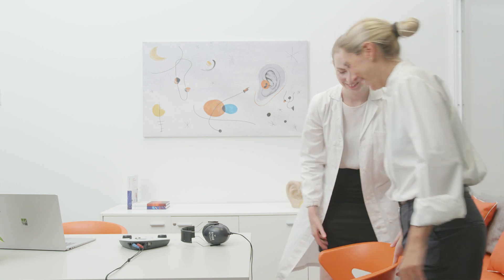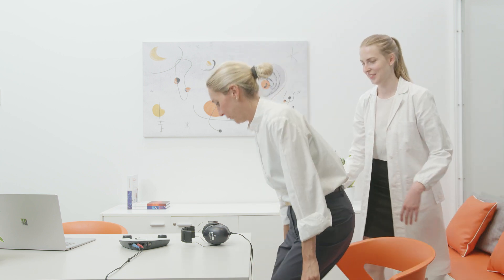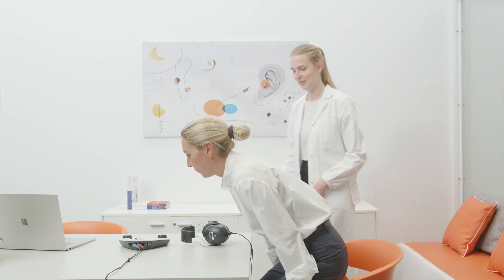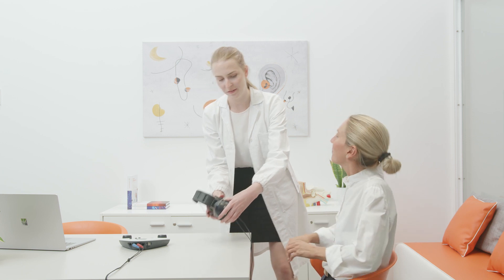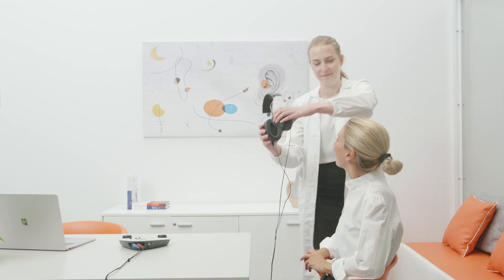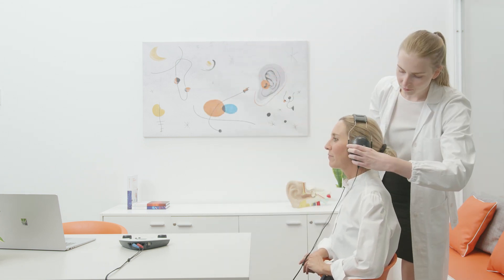Welcome to the Inventus Triangle tutorial video series. During this video we will take a look at the available settings and the simplicity of performing automatic pure tone audiometry with the Triangle screening audiometer.